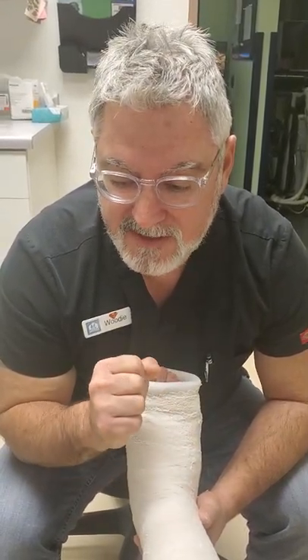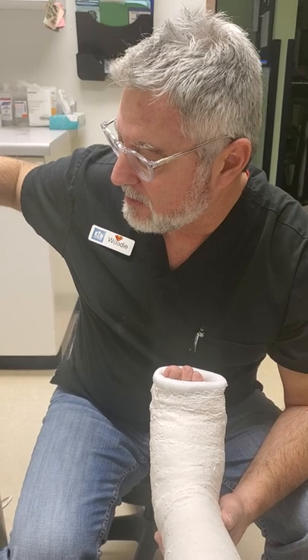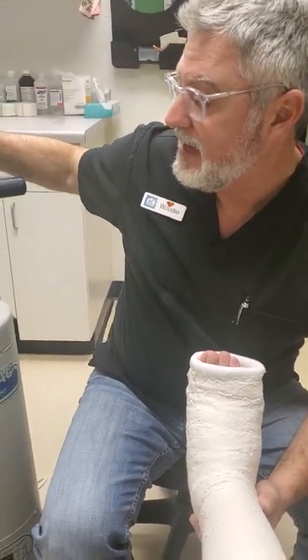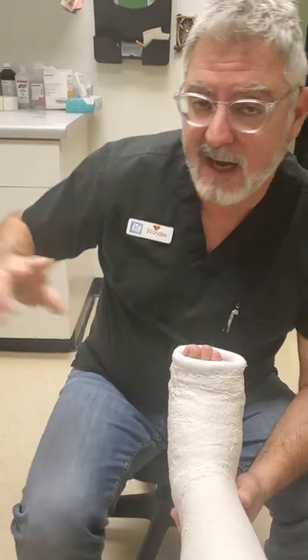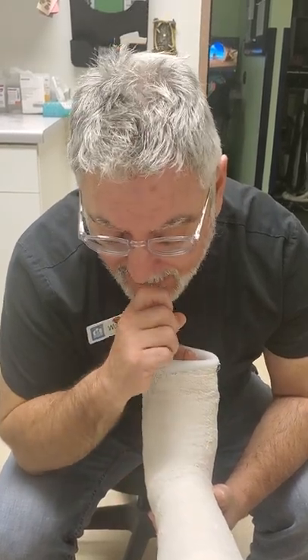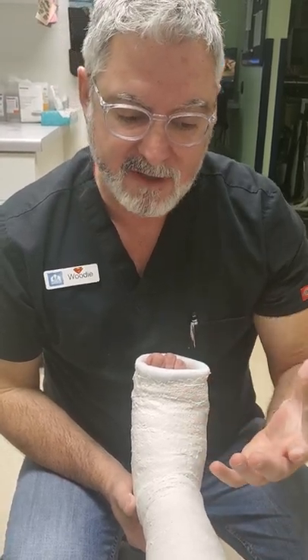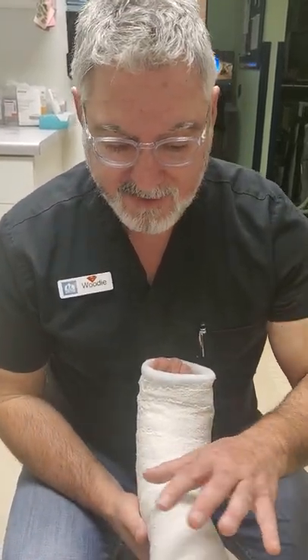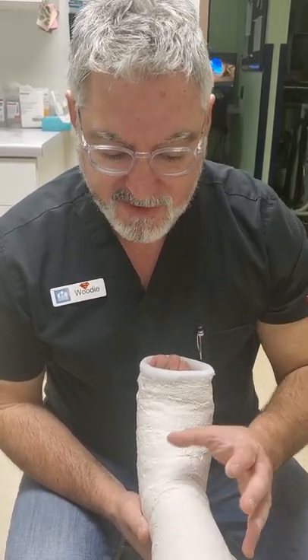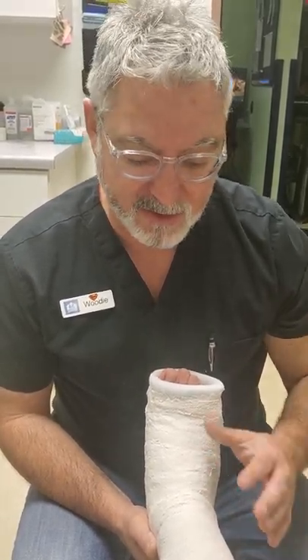For example, if somebody is very adamant that they do not want to use a cast saw on their child, with the doctor's permission they can remove a plaster cast at home. Like they used to do in the old days — before the days of the cast saw, they'd have the patient come in, soak the cast, either wrap it with wet towels or literally soak it in a bucket or a deep sink. As the plaster would start to soften, you could actually cut it.